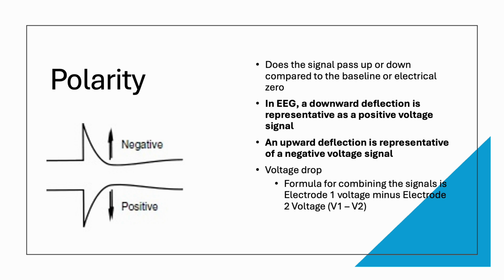A differential amplifier works by subtracting the voltage of an electrical baseline like the mastoid from the exploring electrode to come up with a value, and that's what we see on a tracing. When dealing with EEG or sleep tracing, the V's are commonly referred to as G's. Voltage 1, voltage 2. When we see G1 and G2, that actually stands for grid.